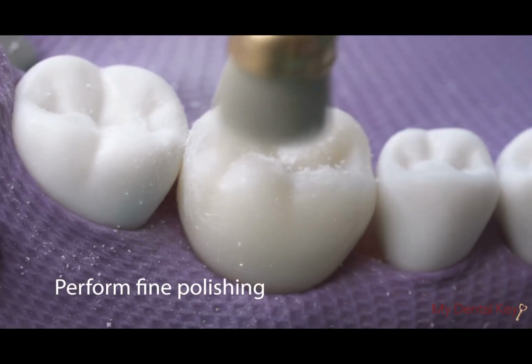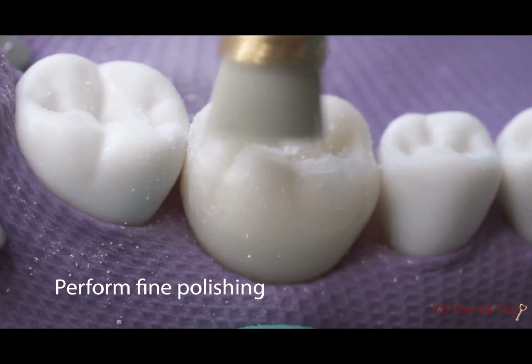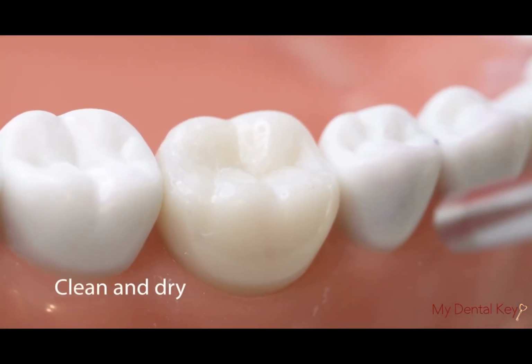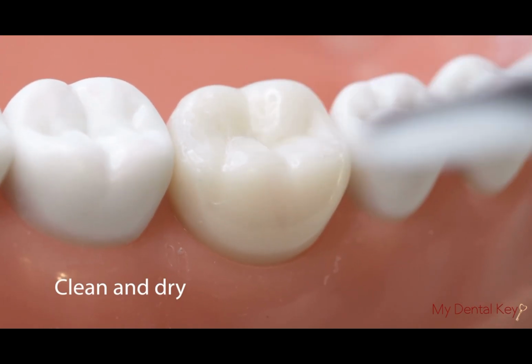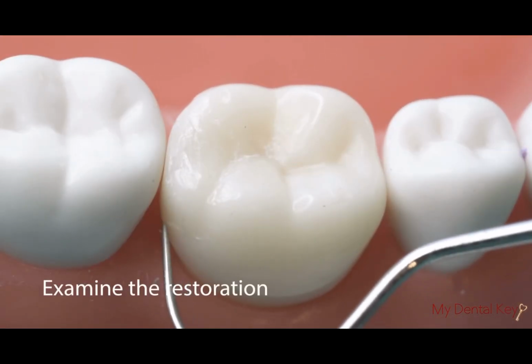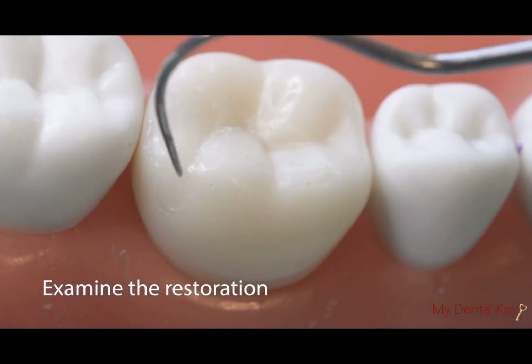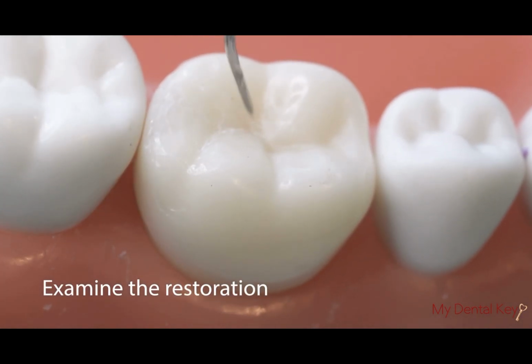Perform fine polishing of your restoration as needed with or without the rubber dam. Clean and dry the restoration using your air water syringe. Examine the restoration. Use your explorer to check for a smooth transition from tooth structure to restoration.